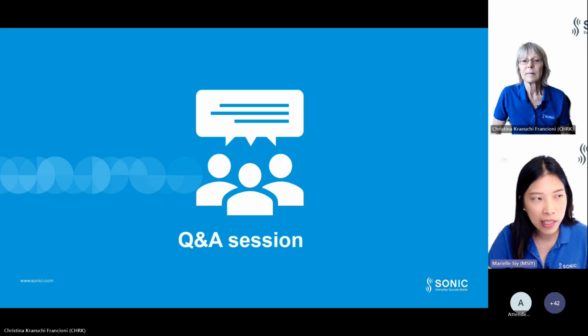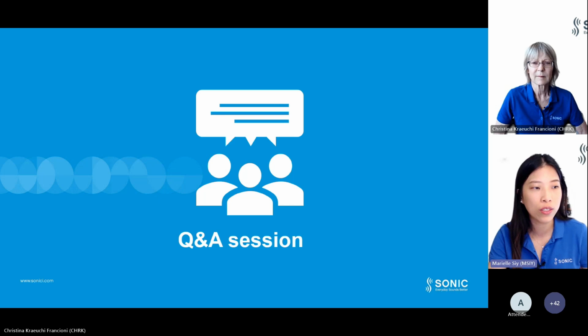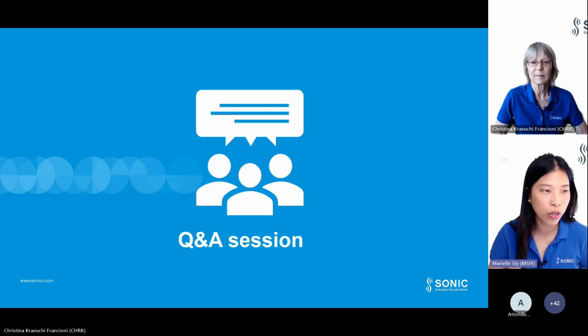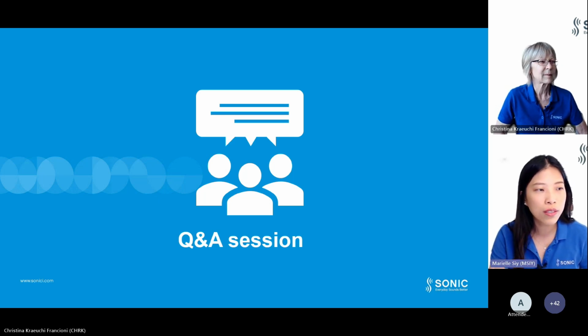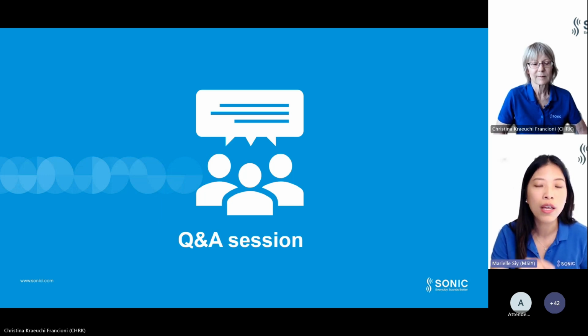Whoever asked this question, I'm not sure if I got your whole question, but just to make it clear, if you want to benefit from direct one-way streaming using the ASHA protocol, the Android device needs to have Android 10 OS, and the Android device also needs to be compatible with the ASHA protocol. So these are two requirements.